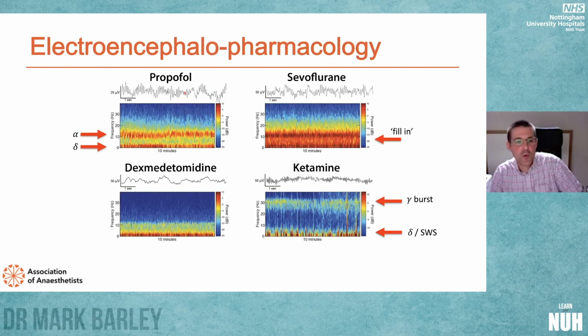So this is particularly cool. All of our different drugs act on slightly different combinations of receptors and neurons and have different inhibitory or excitatory effects. Propofol produces a very particular pattern, which is thalamocortical dissociation. This is a delta alpha pattern. So we've got these lovely tram tracks, if you like, picture here of alpha oscillations and delta oscillations.